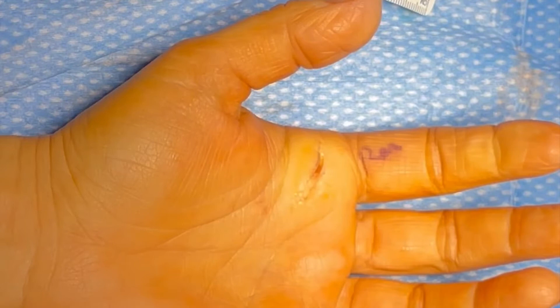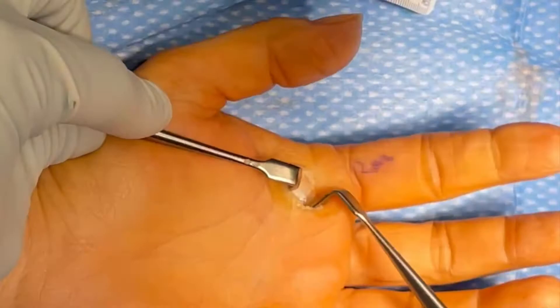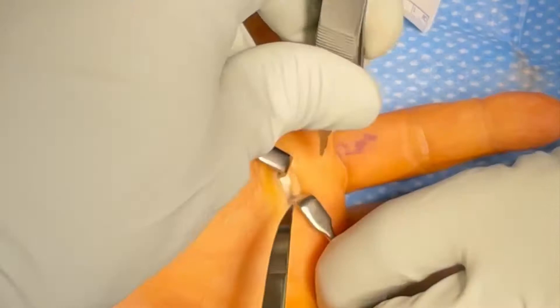At this point in surgery I'm going to perform an A1 pulley release and partial excision. The first reason is to remove any remaining tumor that might be left behind, because this tumor was relatively adherent to the A1 pulley. The second reason is to perform a trigger finger release so that the patient does not develop a trigger finger later, and also so that if a future surgeon sees this scar they'll know a release has already been performed — helping prevent recurrence.